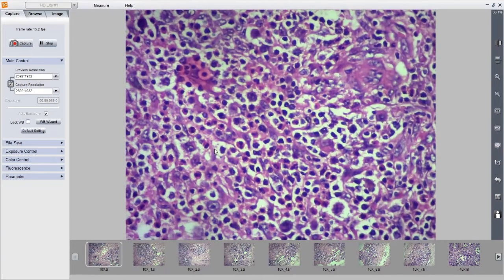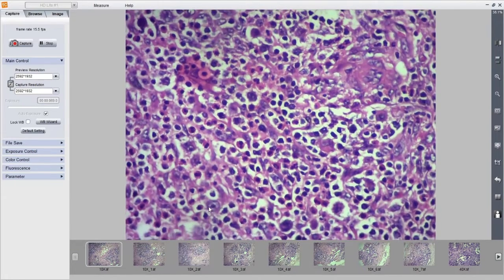Very nice eosinophils, no? Whenever you see eosinophils, very happy. Most probably it's going to be Hodgkin lymphoma. So what are the other conditions where you get eosinophils in a lymph node? Anyone? Eosinophils in a lymph node. What are the differentials that we should think about? These are RS cells. Very nice, beautiful RS cells, Hodgkin cells.